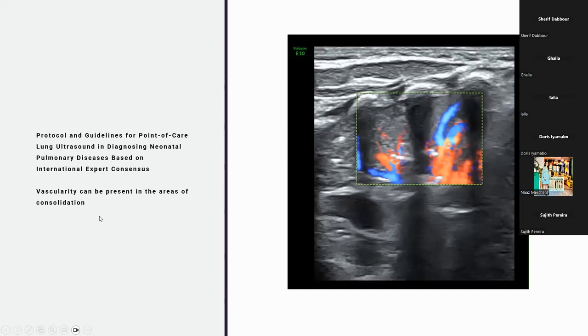I will present a case maybe next time to show you. But if you have chronic lung disease and a large lobar consolidation, that obviously will need more pressure. It'll need a longer period of time. Clinically, what I'm really looking for is clinical improvement first. I would base my lung ultrasound timing on the clinical appearance of the baby.